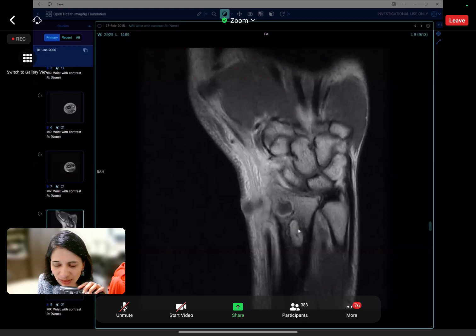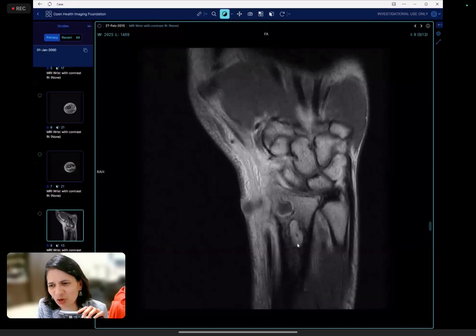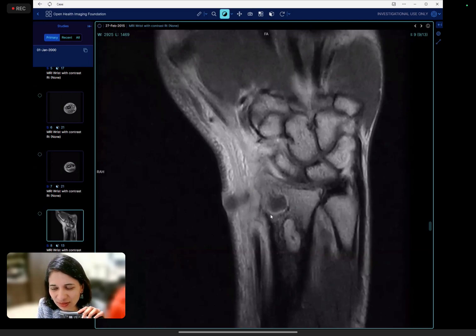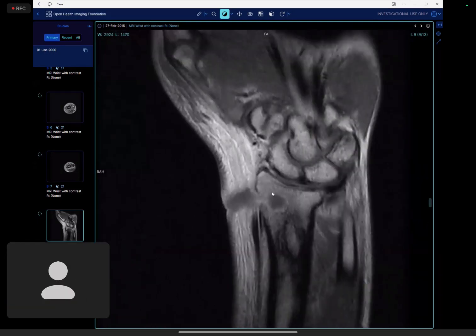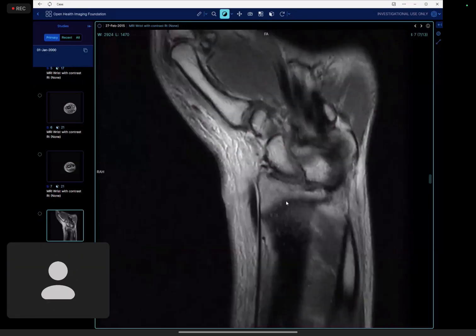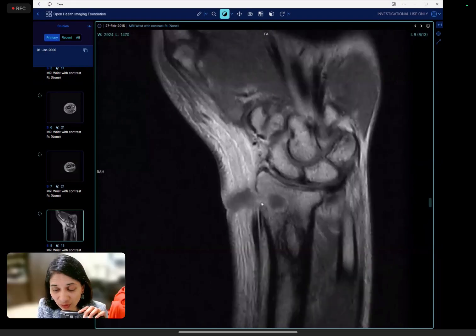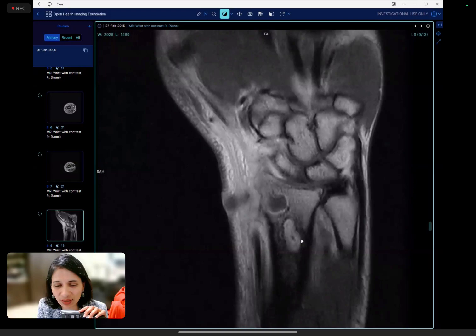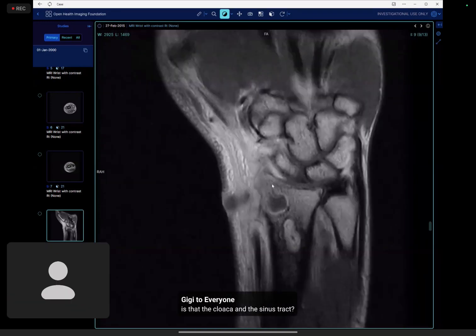Now, if the surgeon goes and tries to get something from there, he will say, "Oh, I think you were wrong. There was no pus at all." They have to go for this, because this is fluid, and that's why it's not enhancing. Whereas this is like a little bit more chronic, like it's dead, and it's enhancing. This is the bit that will be like fluid. If they put a needle in, they will get pus there. So having that post contrast to show the fluid collection, where if they want to aspirate, that's what they need to go for. This will be like a biopsy, and they need to culture, because if they put a needle in, they're not going to get pus there. So that will be this one.